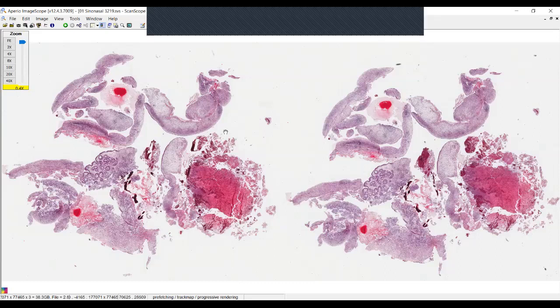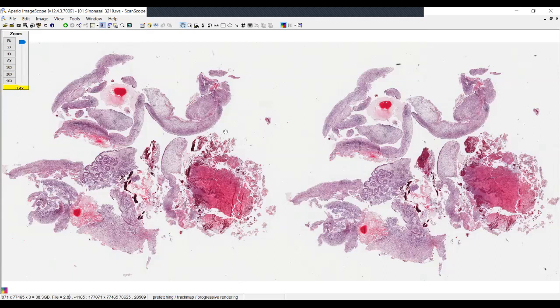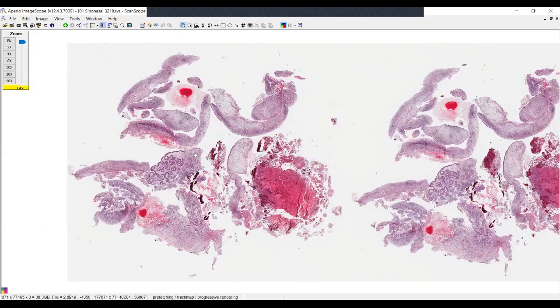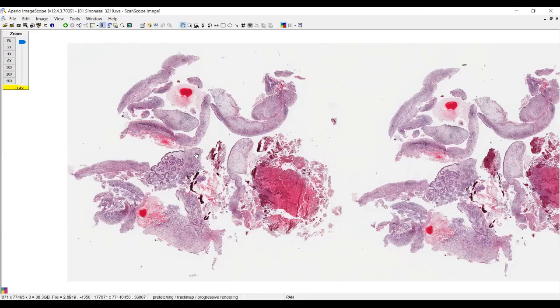Whenever I look at an initial case, I always think, okay, what is it that I should be seeing? What should I look at? What are the most important things for me to review? And so in that particular context, I think with all of the sinonasal tract lesions, there are always just a lot of small fragments of tissue. And so it probably is important just to state at the very beginning to try and review all of the material in order to have a meaningful interpretation.